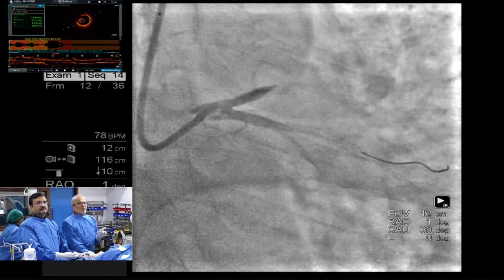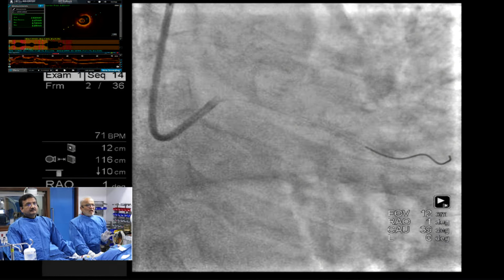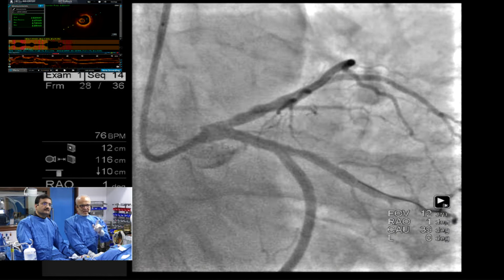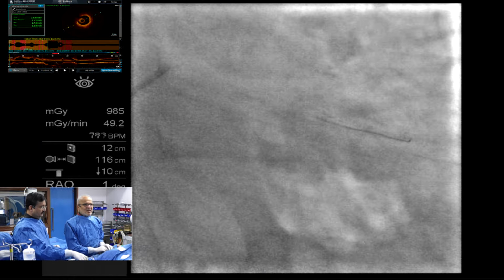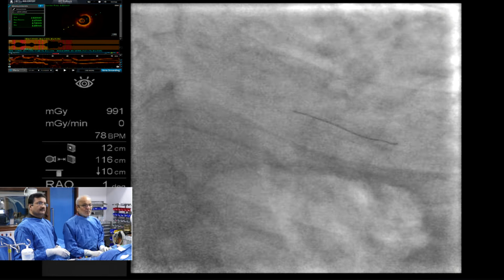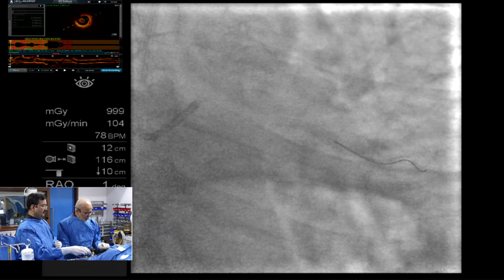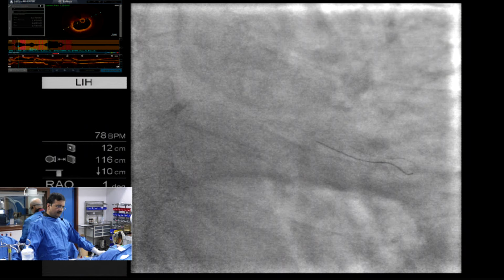So now it's a $1 million question. How aggressively you dilate and with what size you will dilate that ectatic segment and even the other segment. Right. I think proximally, how big do you want it to be? That's what my question is. So will you depend on the imaging, or do you dilate and then do imaging? In this case, I would depend on the imaging.